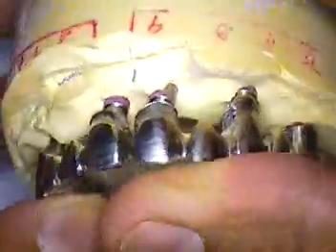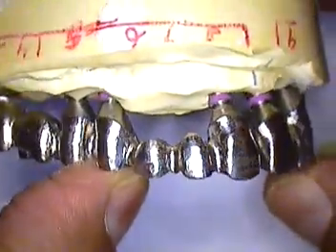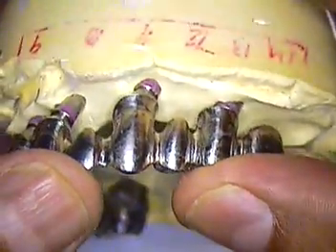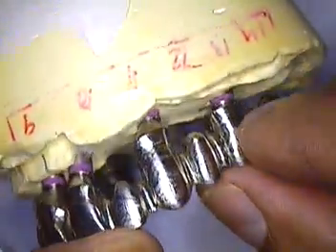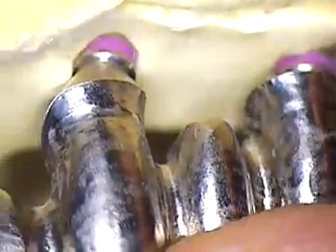This was waxed and cast by hand — it was not digitally made. I would say it's pretty close to the margins. If we were to take each individual abutment off and try it in, it might have just a very, very slight variation in fit, but not enough where we can fit an explorer underneath. So I thought it was pretty exceptional.